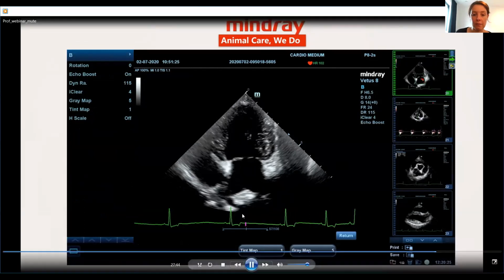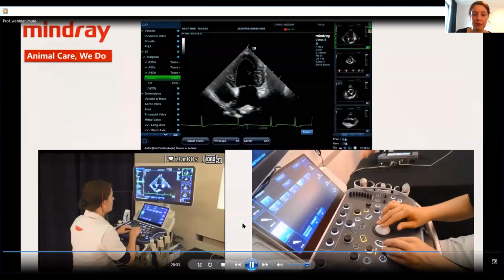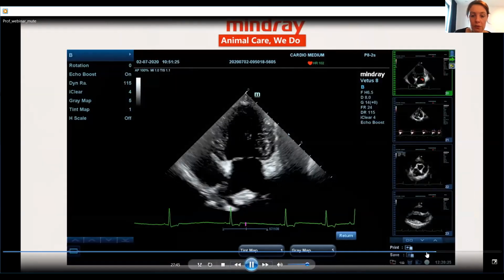And here you saw again how I choose the moment to measure the systole. So we are here behind the T wave, but I actually chose the moment again right before the opening, the closure of the valve. Wait, I will try to go back. Okay, here we are in diastole.